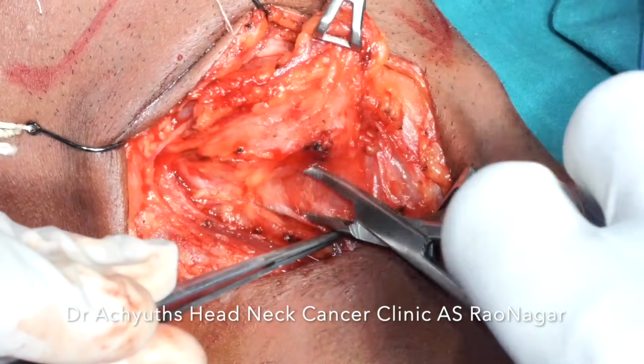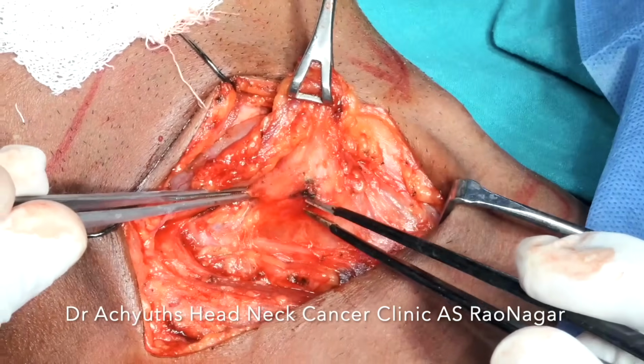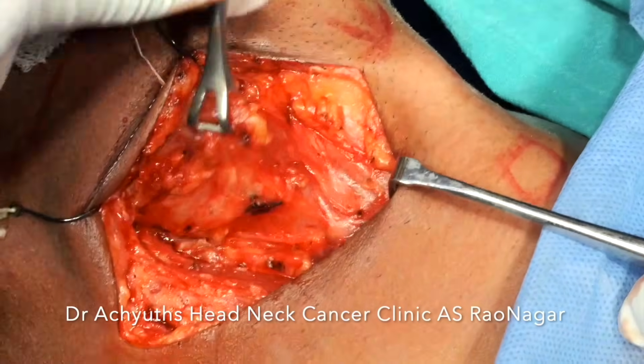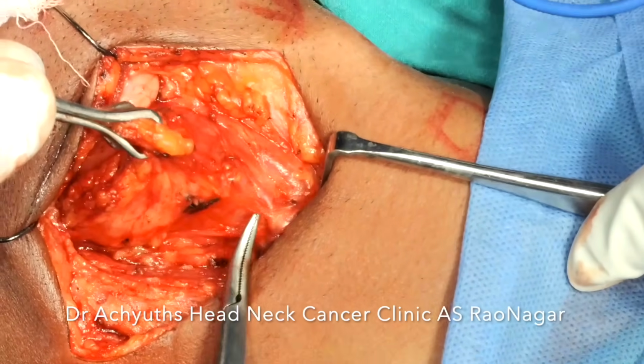So here you can see that a nerve is present on the lateral wall of the cyst, which is divided and dropped down.